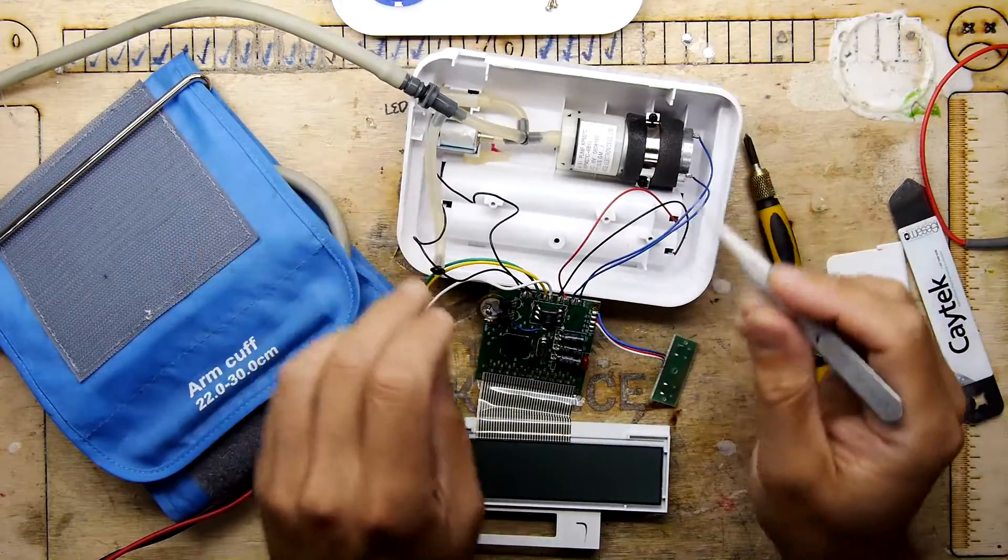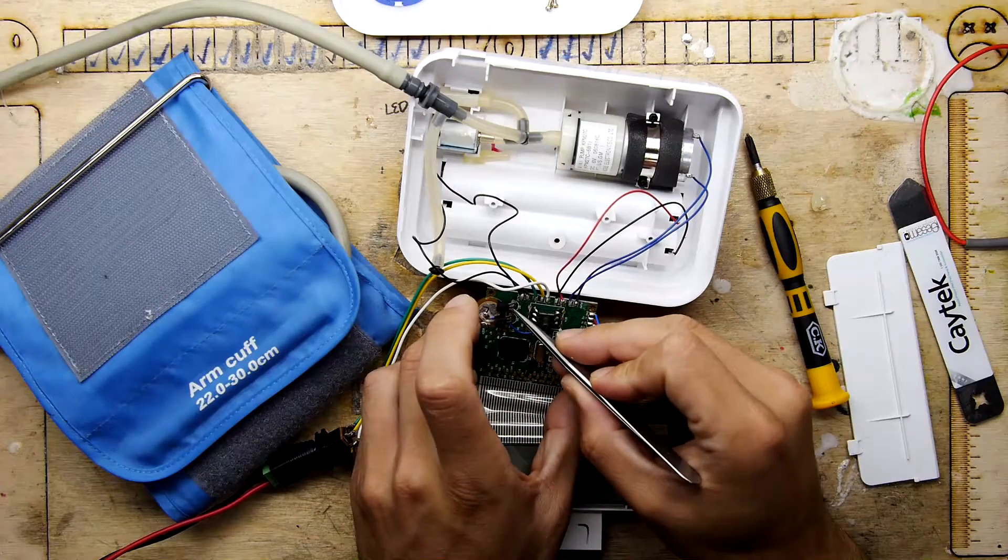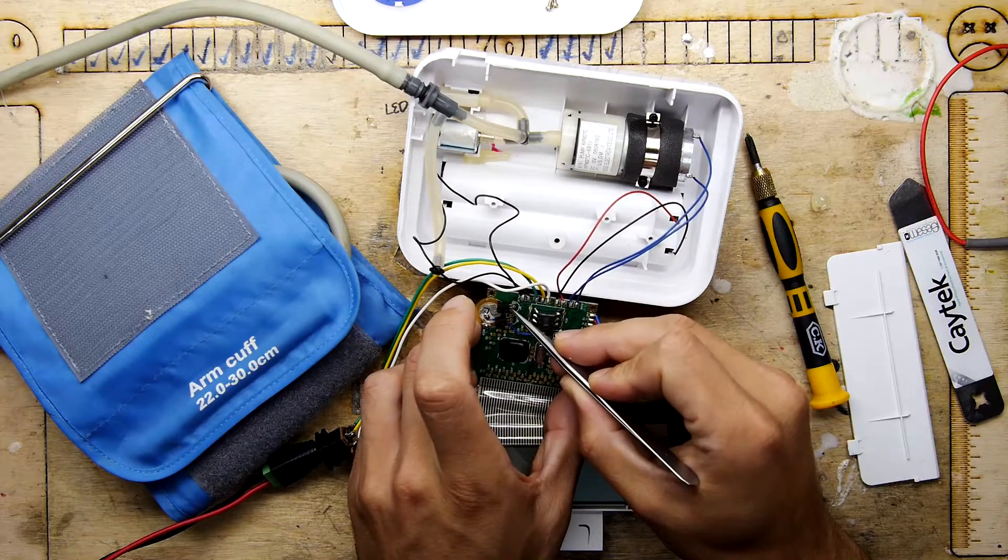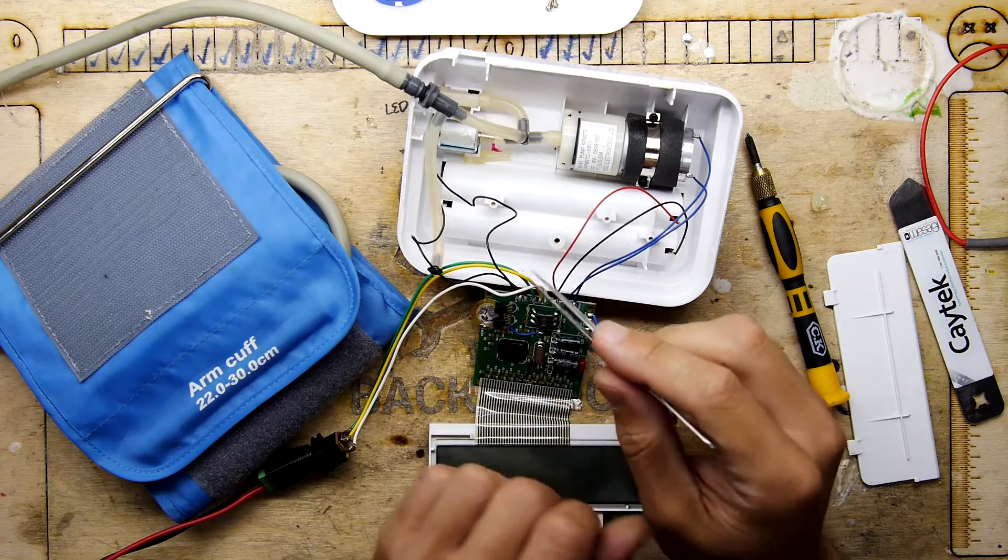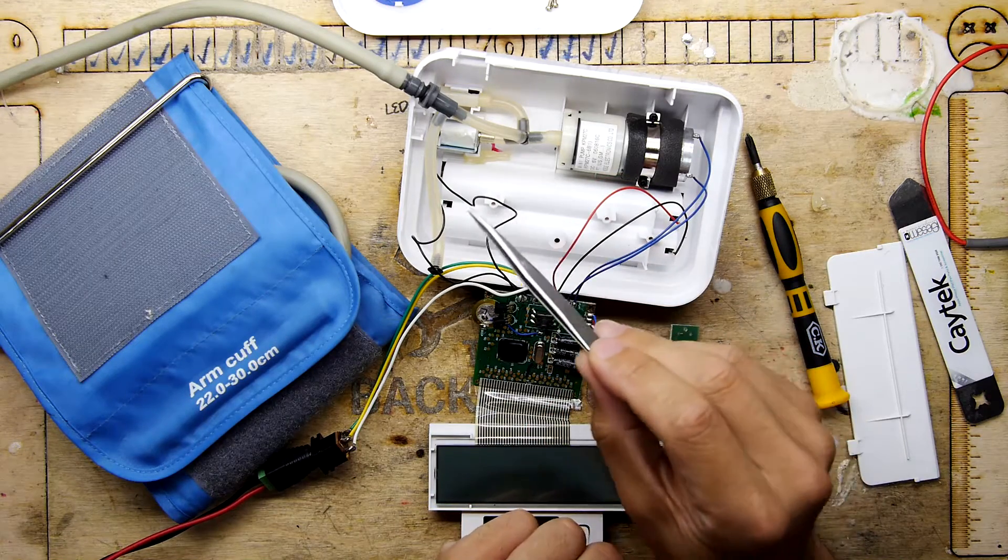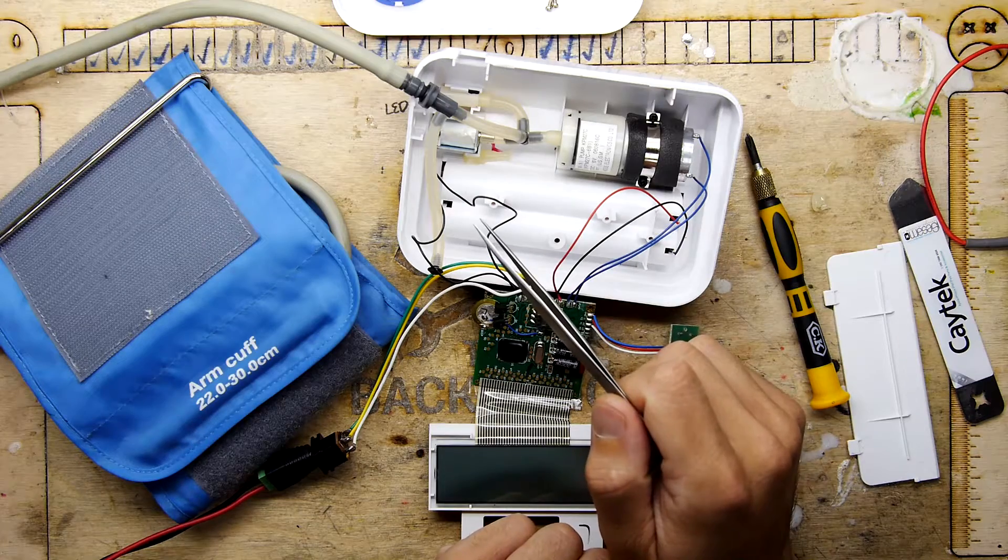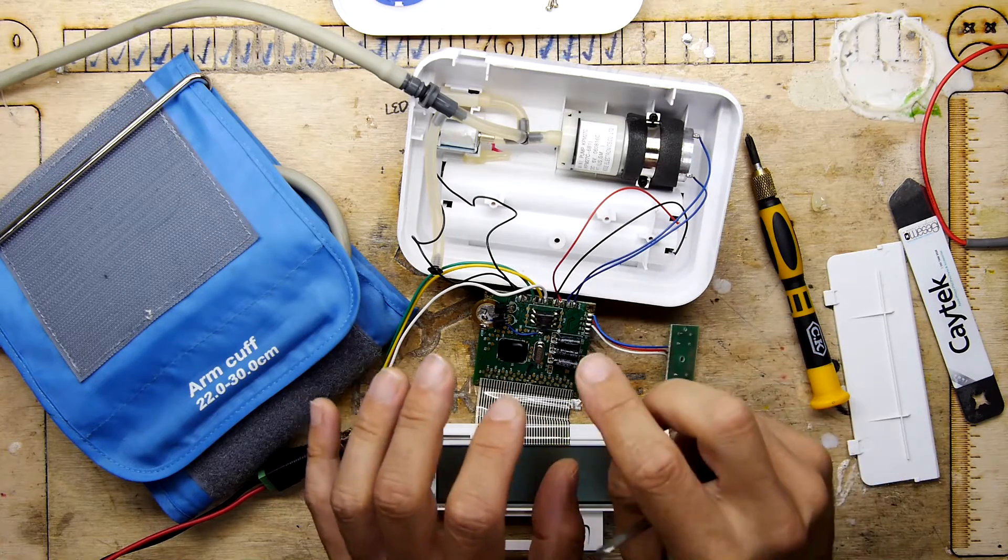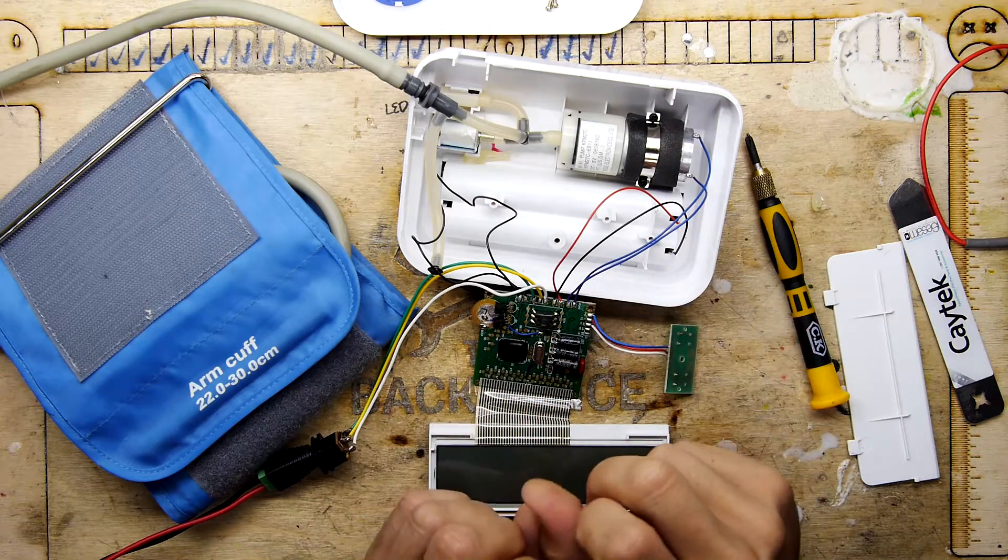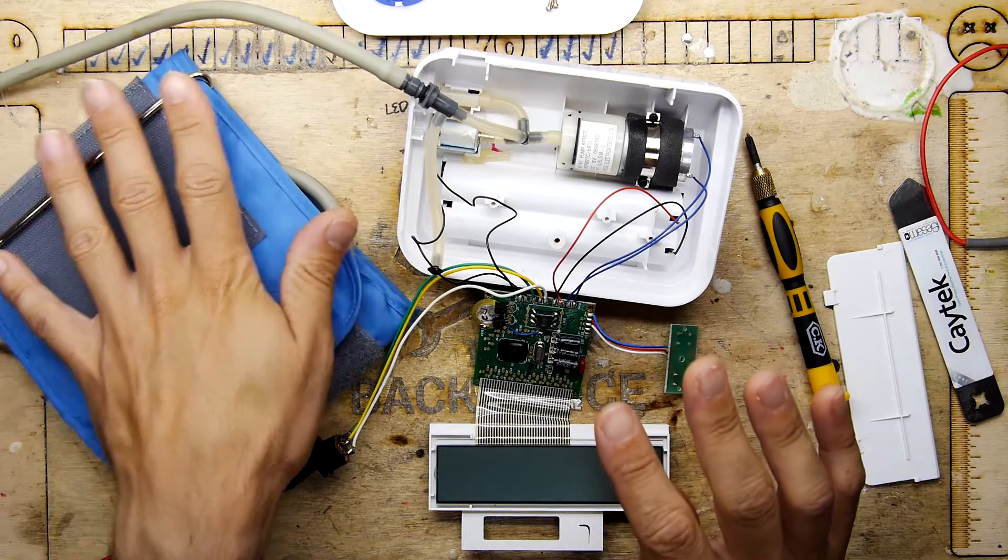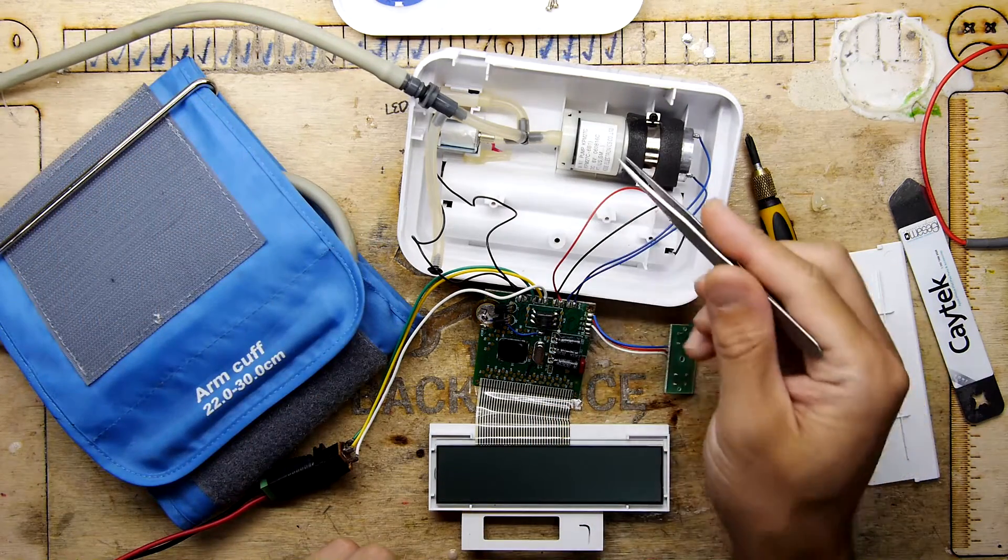And I have discovered, let's see which one's which here. So that one is the valve, the solenoid valve. And interestingly enough, that valve is a safety feature. That valve is actually open by default. So you can imagine if this device loses power or freaks out, it'll just open that valve and let the air out of the cuff. So that's quite neat.